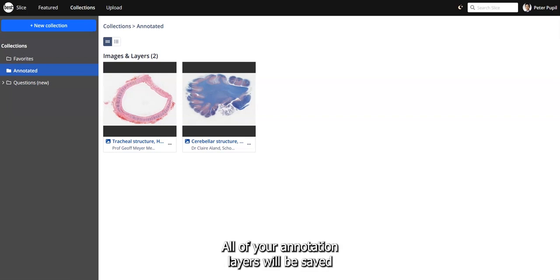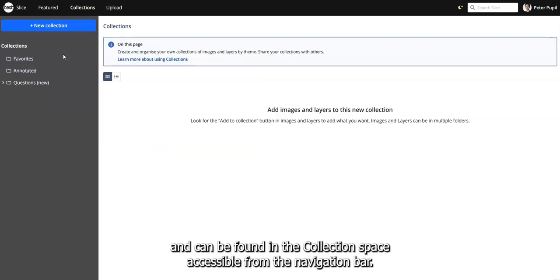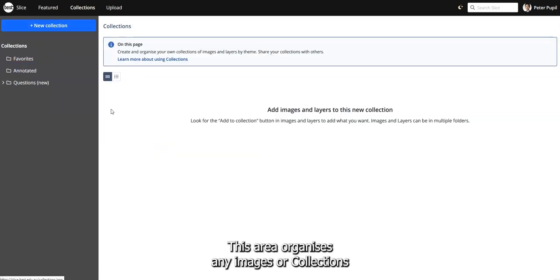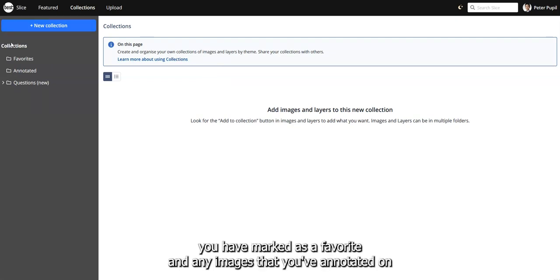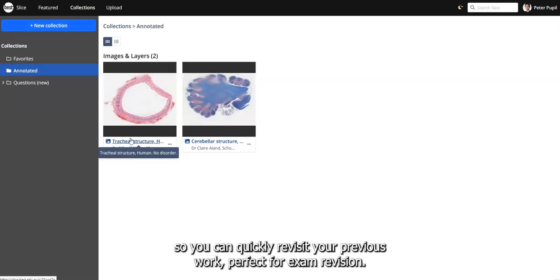All of your annotation layers will be saved and can be found in the collection space, accessible from the navigation bar. This area organises any images or collections you have marked as a favourite and any images that you've annotated on, so you can quickly revisit your previous work — perfect for exam revision.